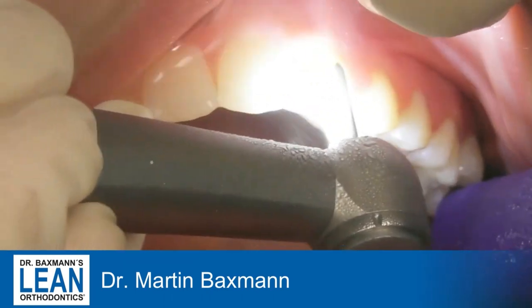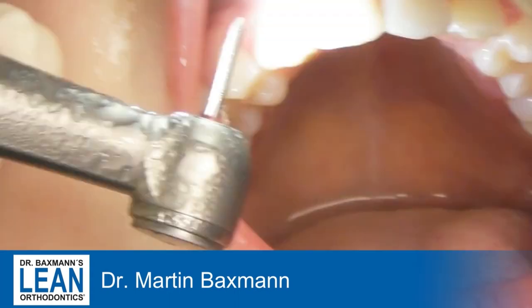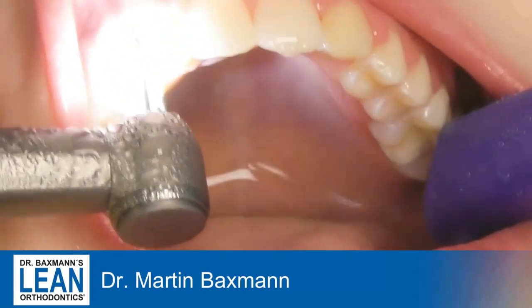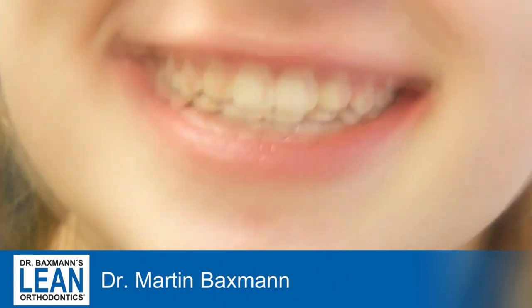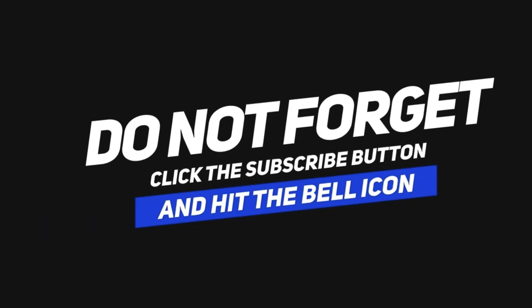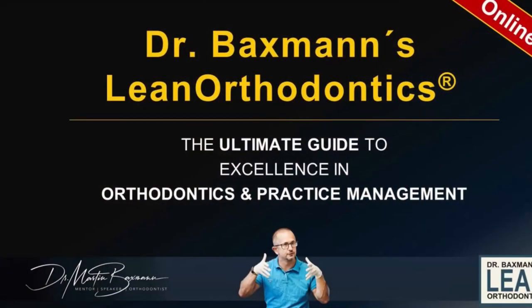Make sure that you don't do just the tip of the canine — do the labial part of it as well, to have a flat surface which is pointing towards the lips, or towards the opposing person looking at the perfect smile of the patient. That looks already much better; it needs a little bit of gingival contouring, but that's it.